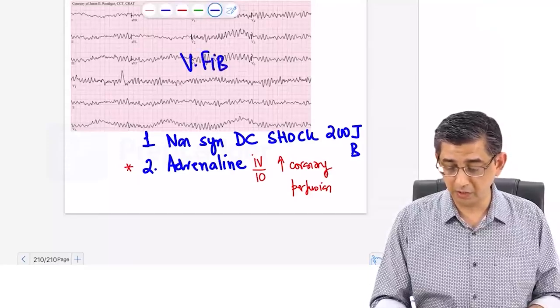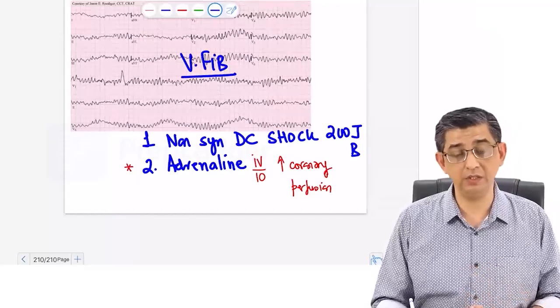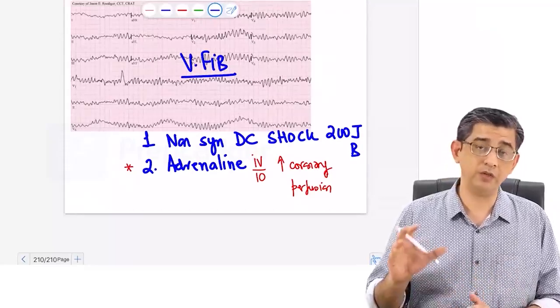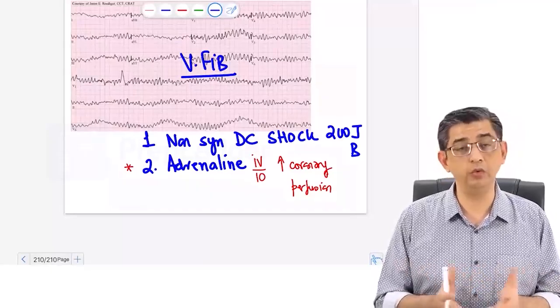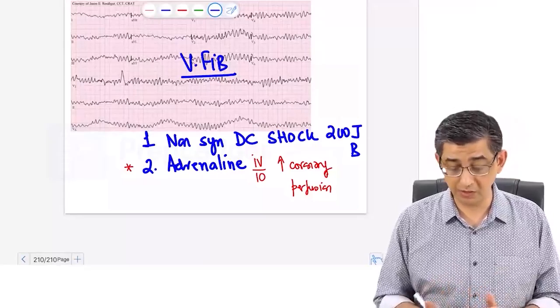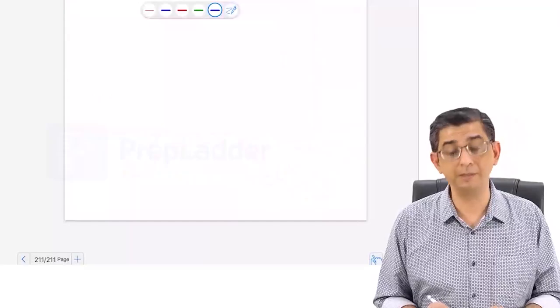Ventricular tachycardia and ventricular fibrillation make the patient pulseless and chances of death are very, very high. So as soon as you put on the defibrillator, once you evaluate the rhythm, you can deliver a DC shock, which would be the non-synchronized variety, and terminate this process.